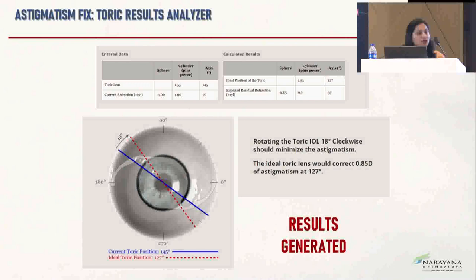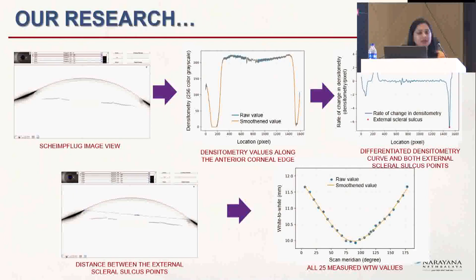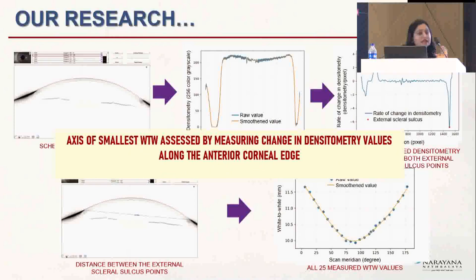So we have been hypothetically doing a study. Usually what happens when we take white to white, we either take it in the vertical or in the horizontal plane. So this is our research where we feel Pentacam has the ability to take around 25 to 50 scans. When you take 25 scans in different meridians, we found that wherever the white to white was the smallest, that was the area of the steep axis.